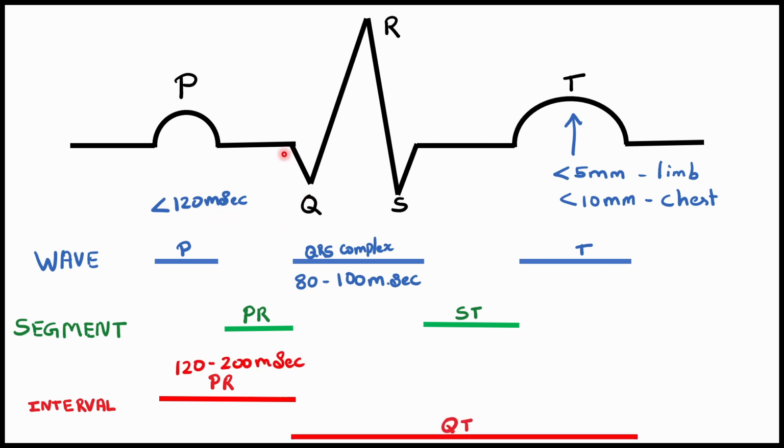And QT interval. It's from the starting of Q till the ending of T wave. So basically QT interval is complete ventricular depolarization and repolarization. QT interval is nearly 360 to 440 milliseconds.